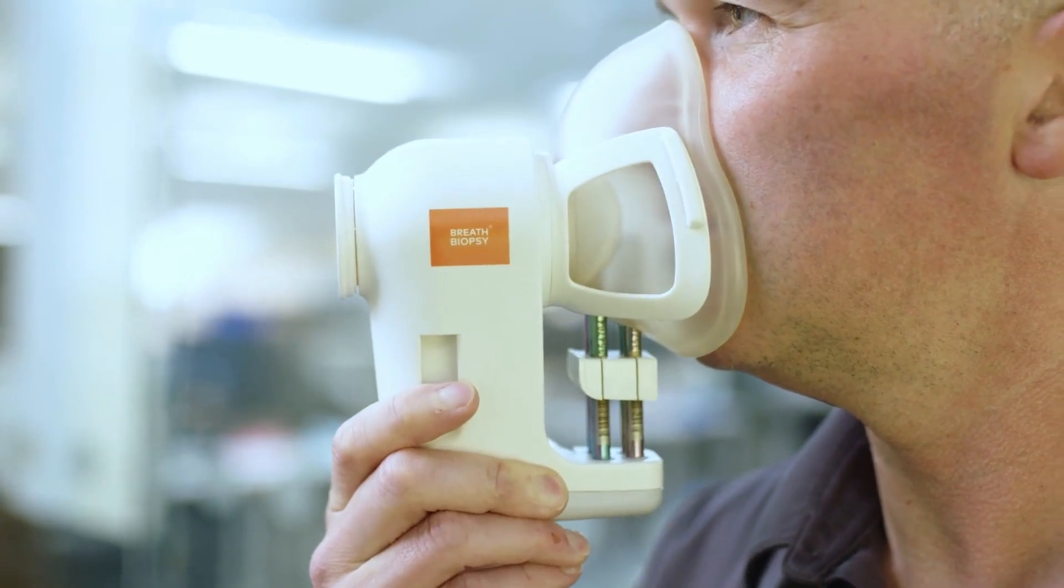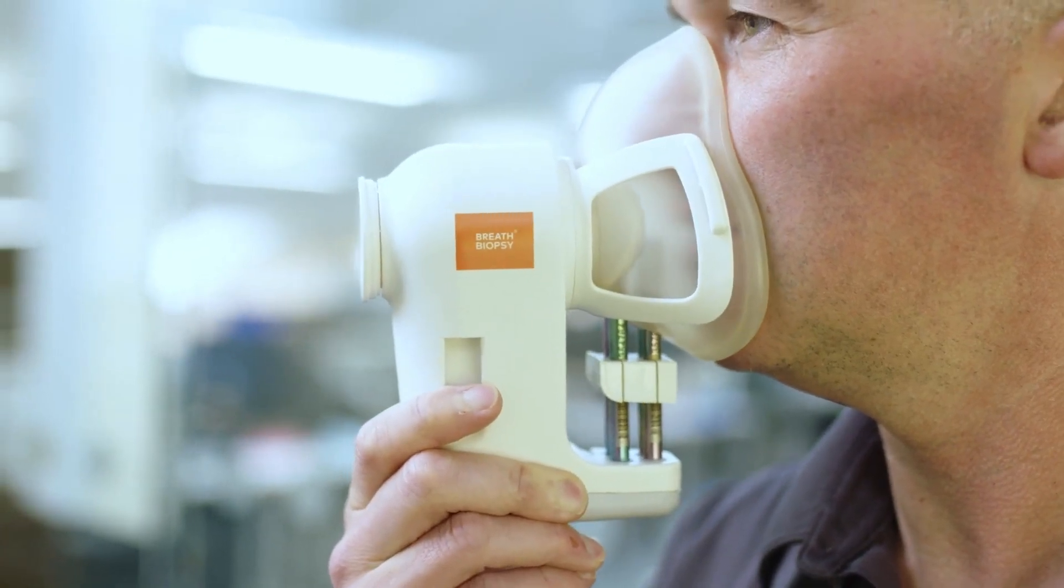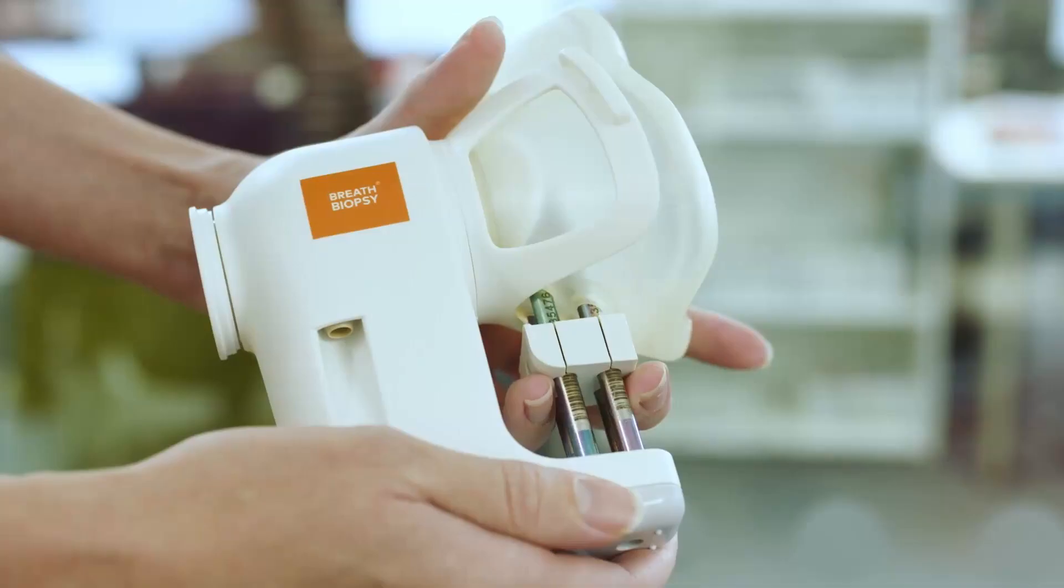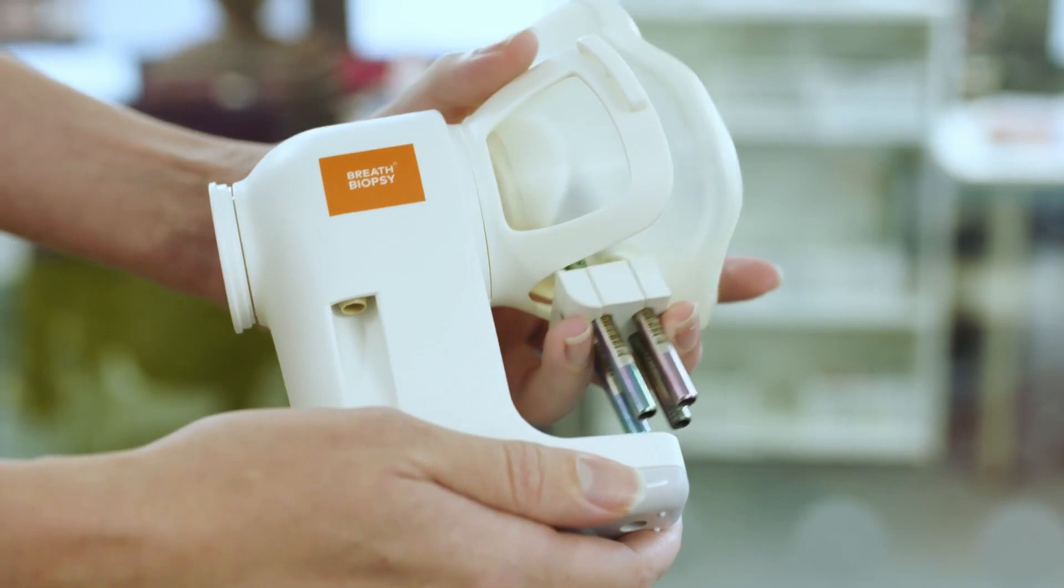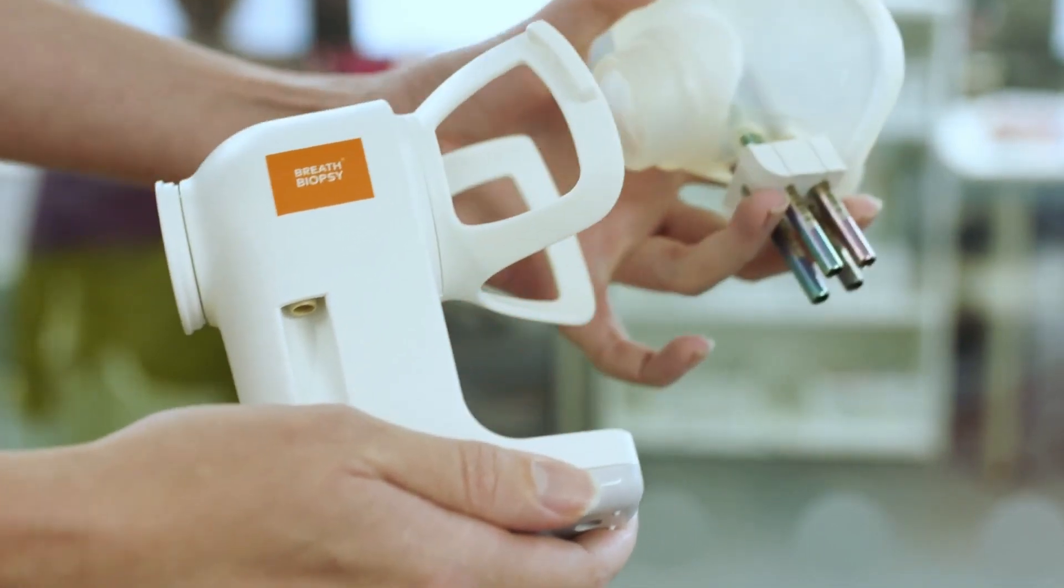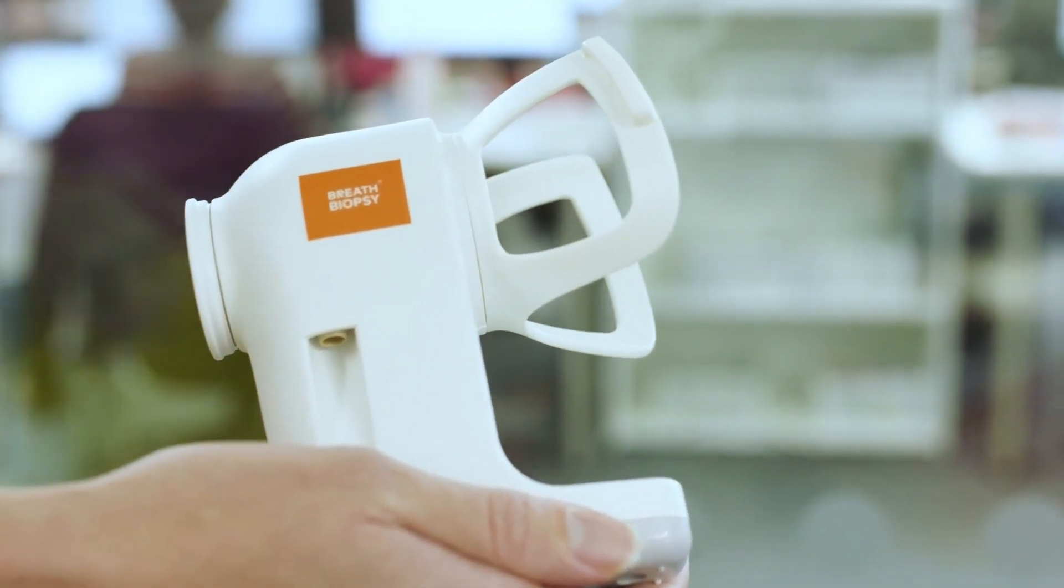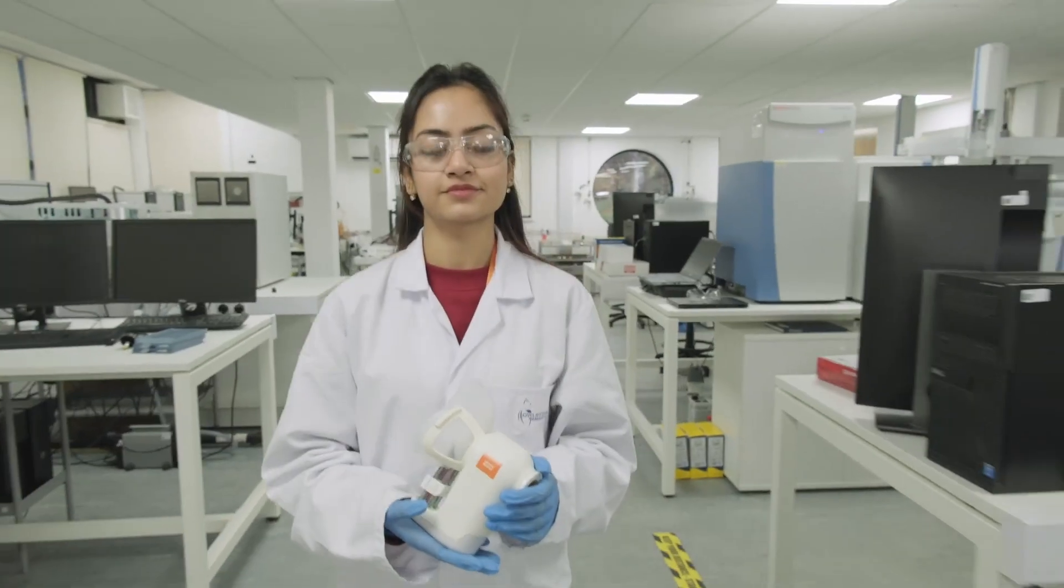We collect the breath samples using the receiver breath collection device and the Casper portable air supply. This groundbreaking technique requires ultra-sensitive instruments and software.